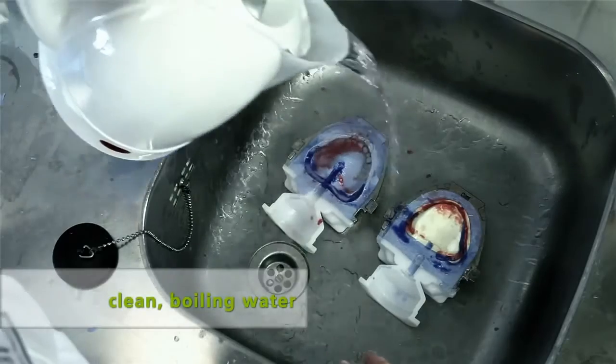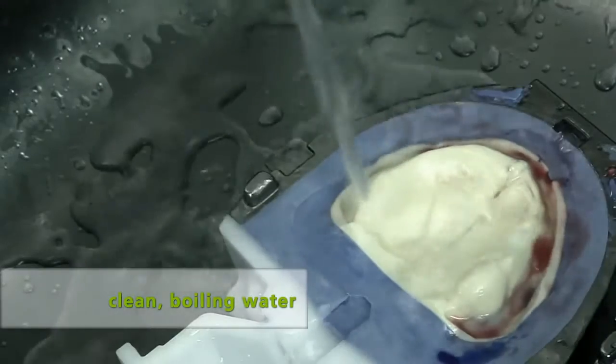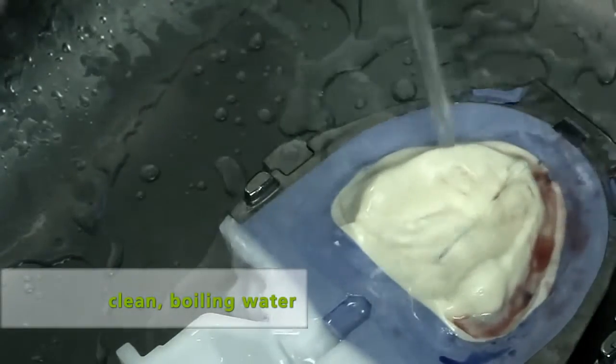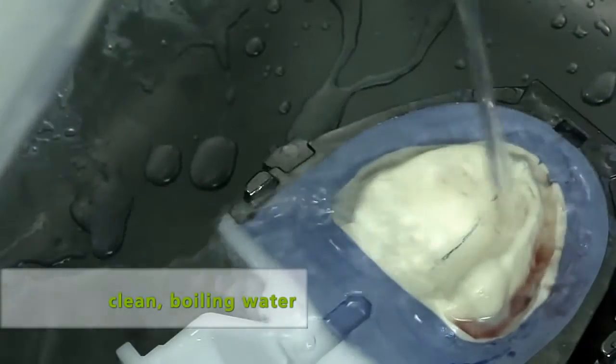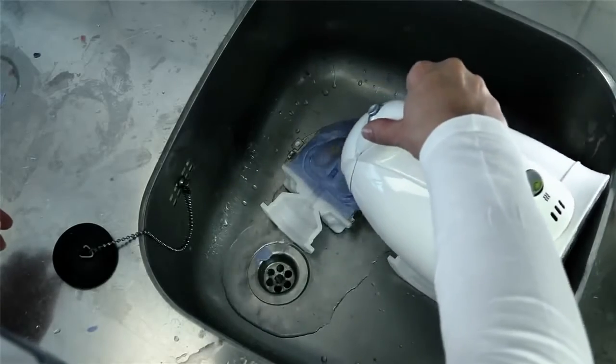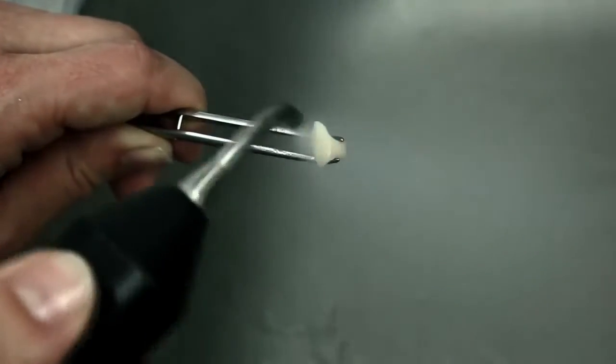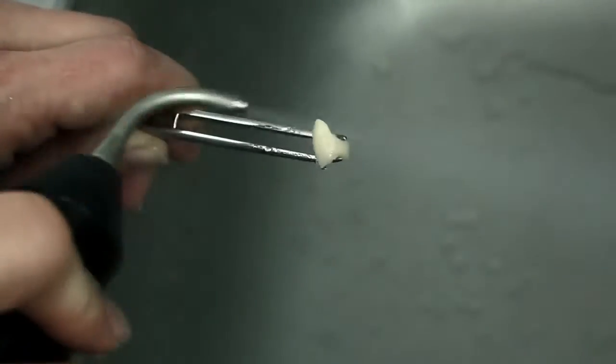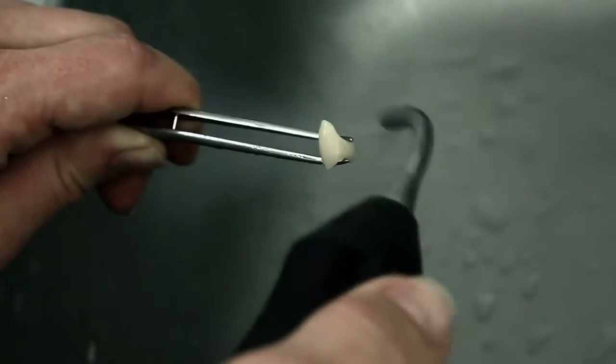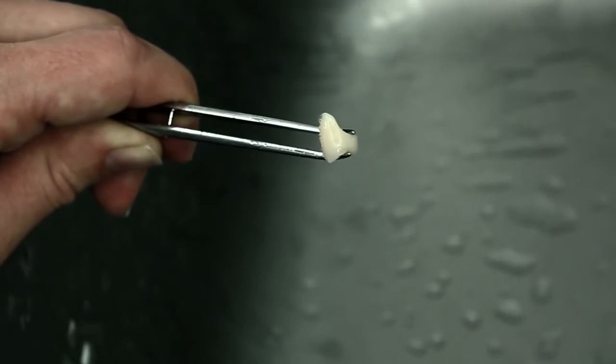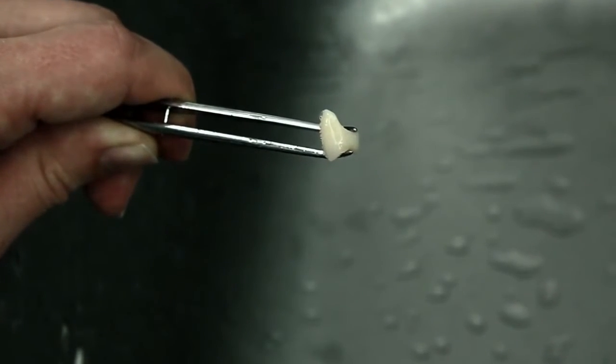Now thoroughly boil out the wax residue at the inner surfaces with clean, boiling water. Use only clean water without additives such as wax solvents or cleaning agents. For an optimum bond between the resin teeth and the denture base resin, the cervical areas of the teeth as well as the basal tooth surfaces must be absolutely free of wax.